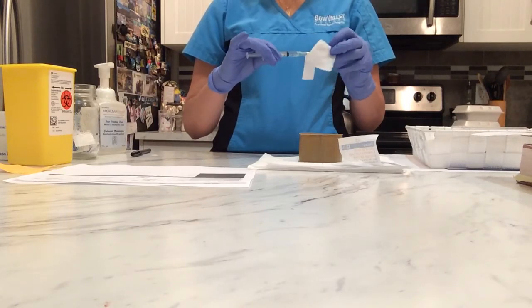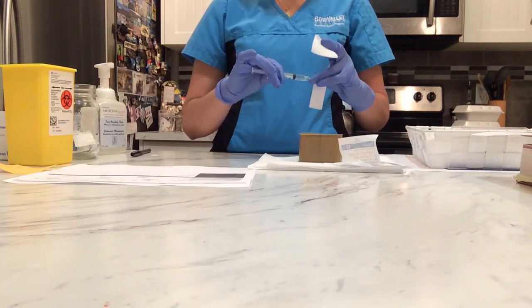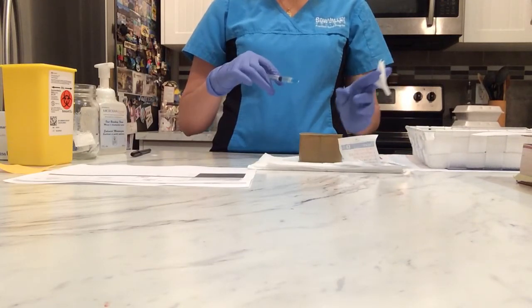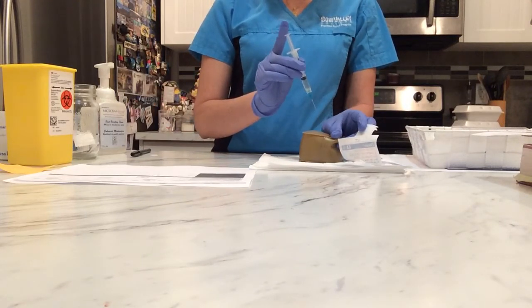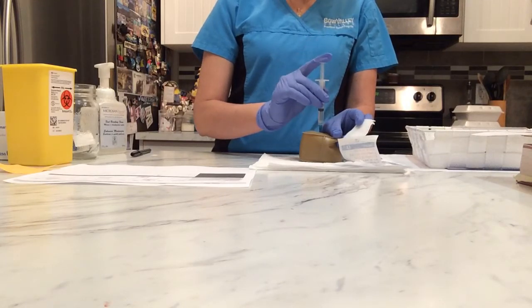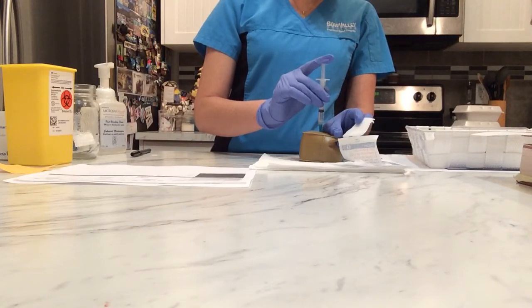Okay, bear with me. I'm going to touch your skin. 1, 2, 3, and I'm going to inject slowly, about 10 seconds per 1 ml.